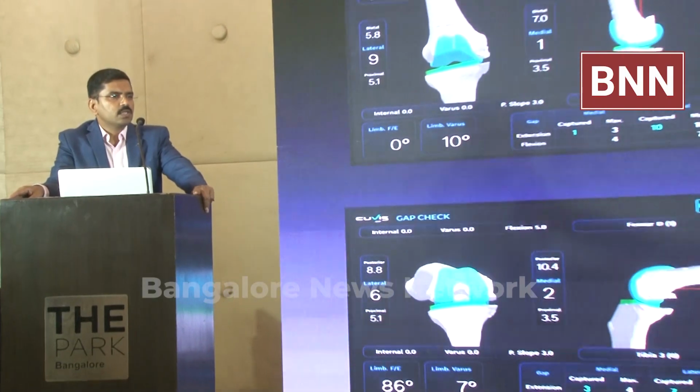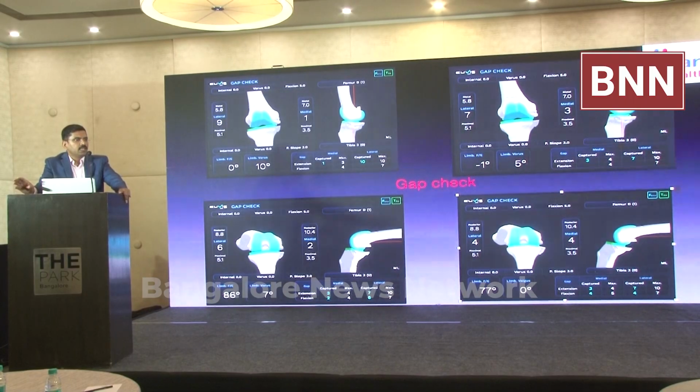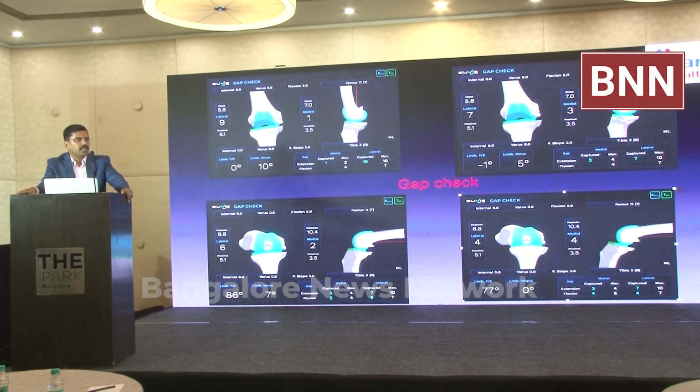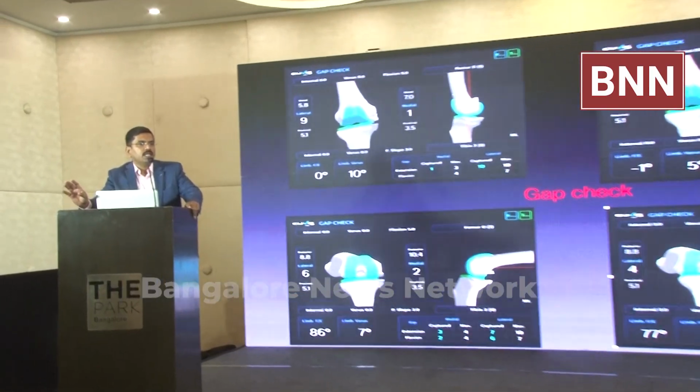And then the deformity also, when we discussed with our deformity surgeon, Dr. Pushottam, he was also of the opinion that it has to be a customized implant only, without correcting other deformities. That's when we finally decided that we will go with the patient specific implant that keeps the native bone structure and does not give stress on the ligament. So this was a specialized implant which is particularly designed for this patient so that this implant will not trouble any other body parts.